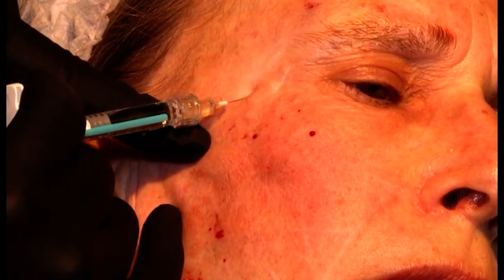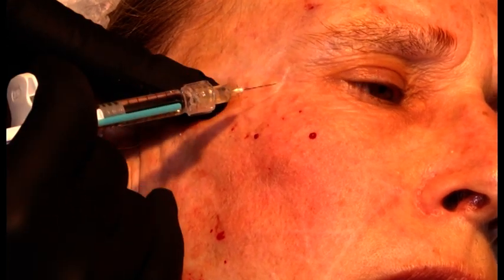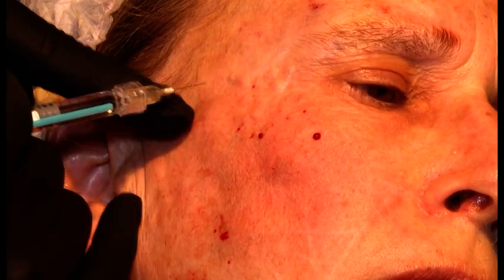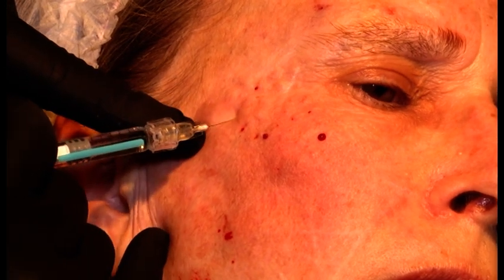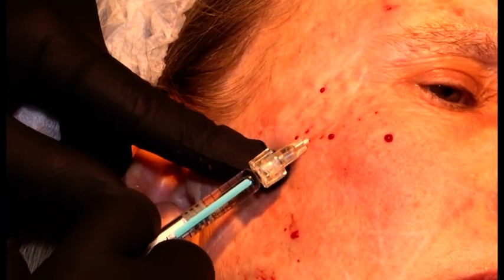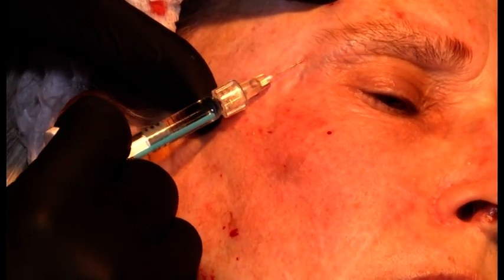And just make sure that you try to avoid these little periorbital vessels that you see a lot in this area. And then after this, you will have a little bit of a bumpy result. So I go a little bit higher.